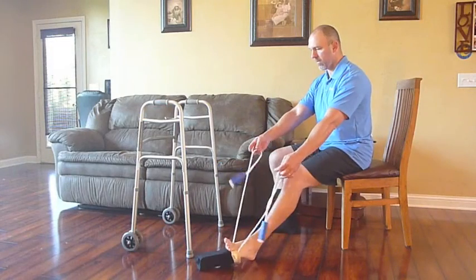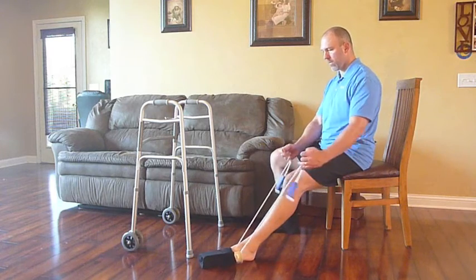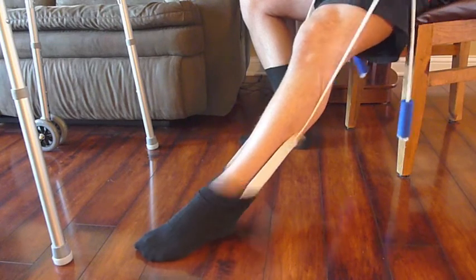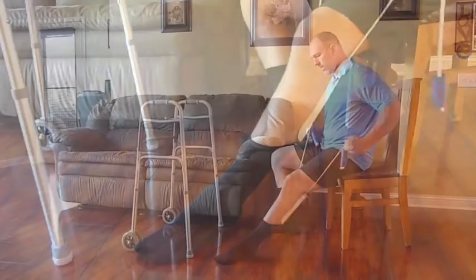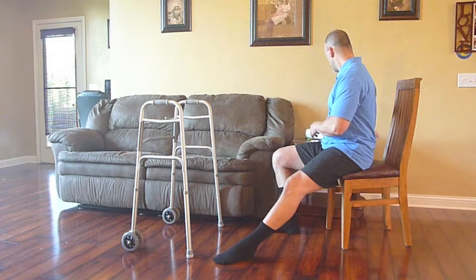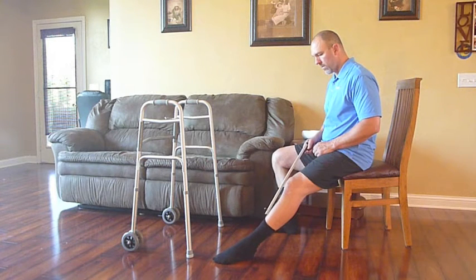Using the straps, toss the sock and the sock aid out in front of the foot, keeping your leg in a good position. Pull on the straps of the sock aid to get it over the heel and up the back of the calf. You can use a reacher to adjust the sock as needed.